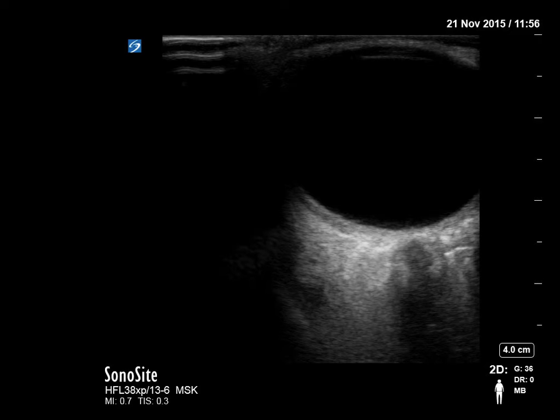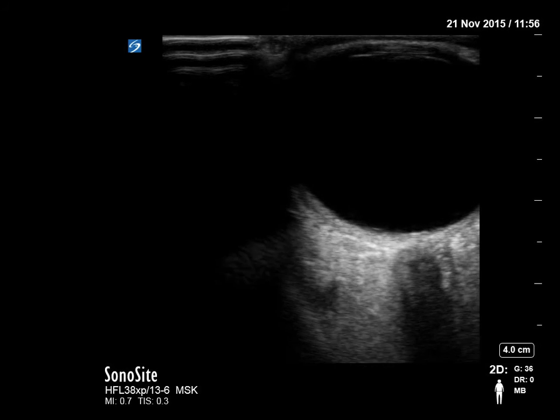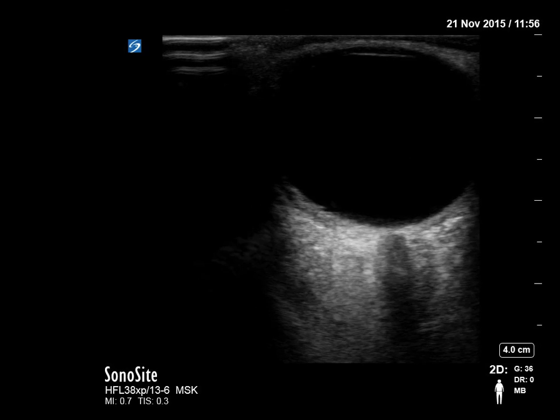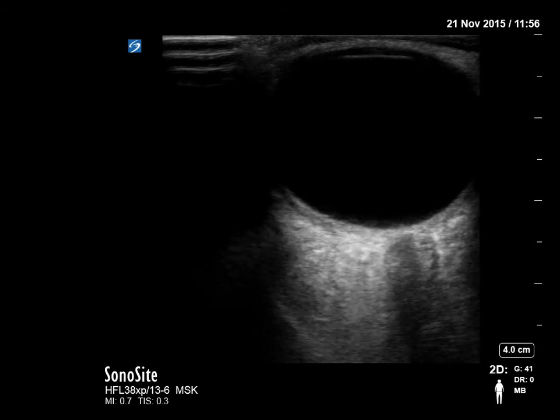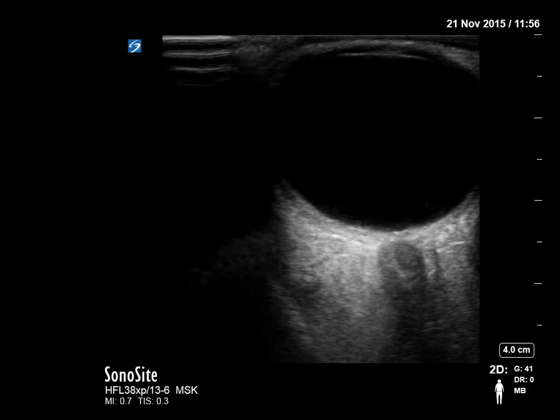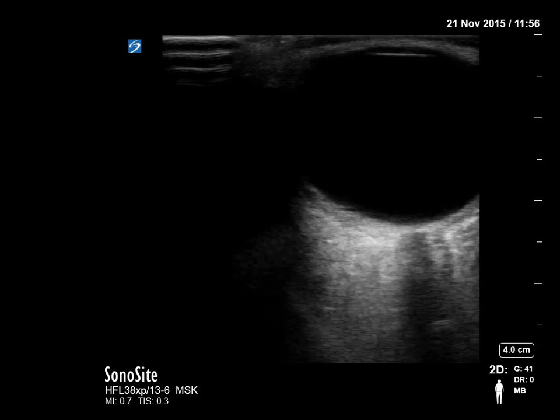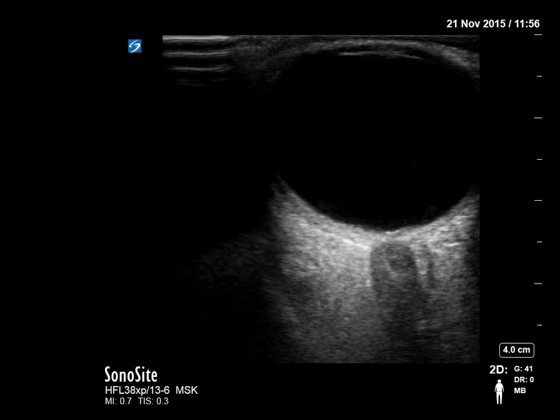This is what you are going to see — a small video clip. You have to see the optic nerve and optic nerve sheath, and inside the sheath there is a thin line of CSF you can see, shown in the lower corner of the screen. You can see the optic nerve and all around it there are thin lines — those are the CSF area. From one point to the other, this is how you measure it.